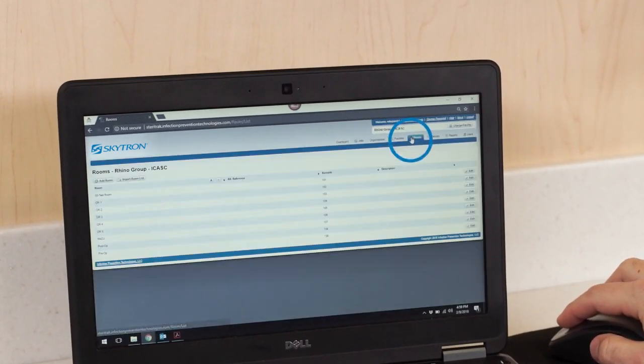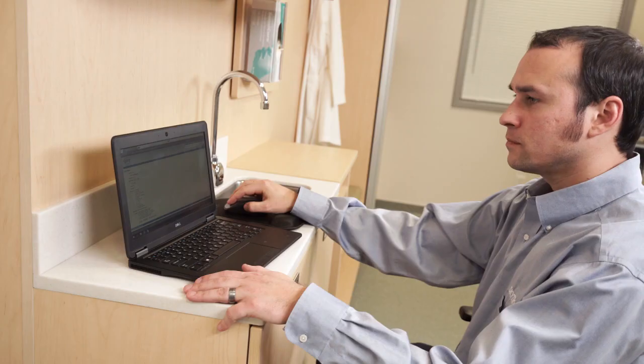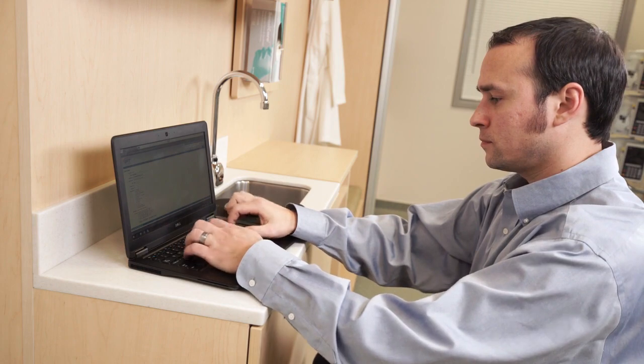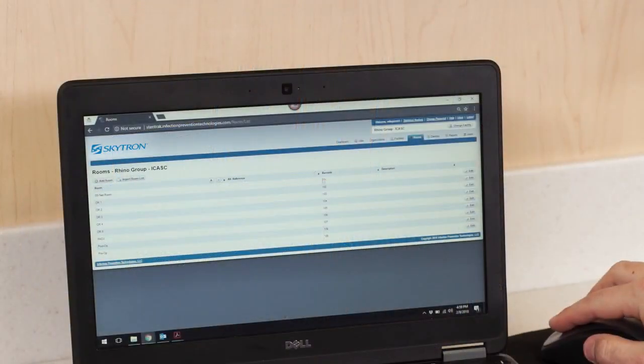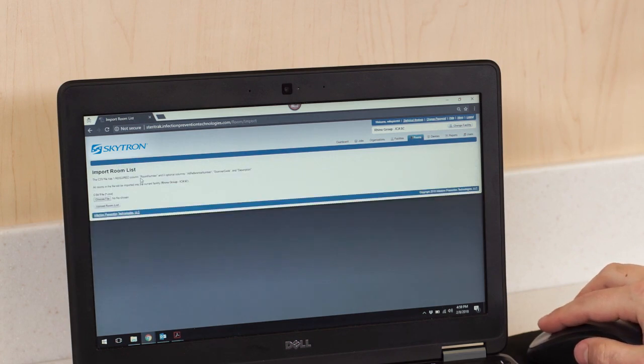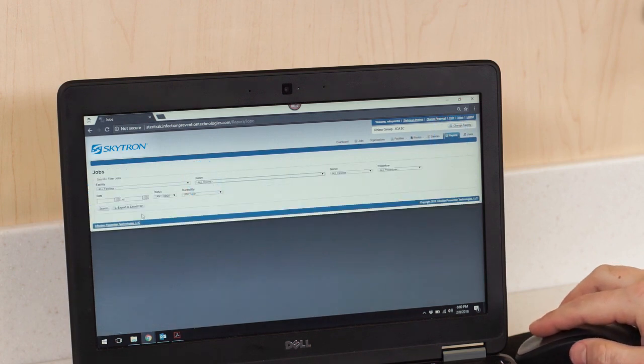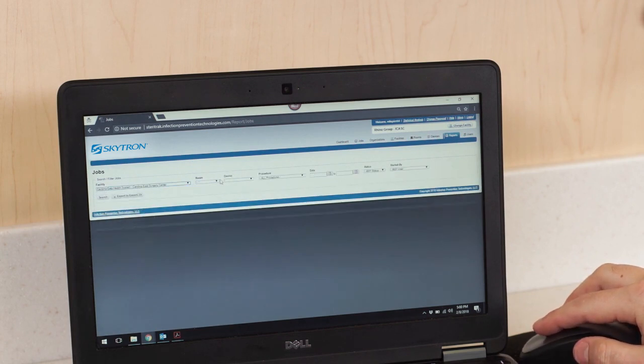Go to the Rooms screen to see all rooms and their corresponding scanner codes in the current facility; you'll be able to enter room information at the push of a button. To import a number of rooms to a facility quickly and efficiently, use the Room Import screen — create a CSV file in Microsoft Excel, then import it to Steritrack. On the Reports screen, you can search and filter jobs by a number of criteria, as well as export a job report to an Excel or CSV file.